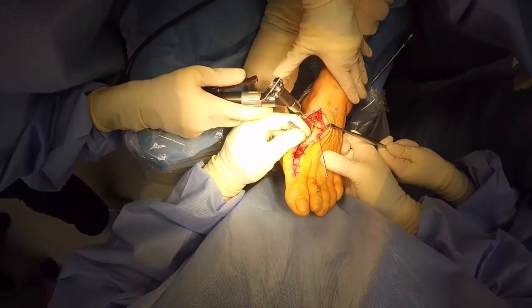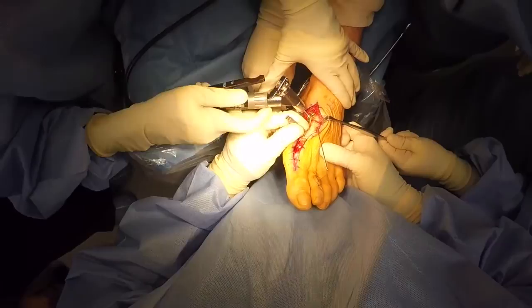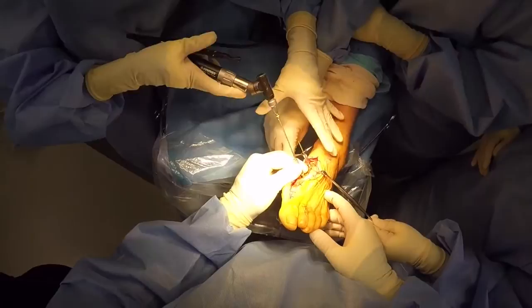Because I don't want to throw away stuff. Is that just all the cables? Yep. All the cables you got there. Still going to use these locking screws. Do you need to go bicortical? No. Go ahead.